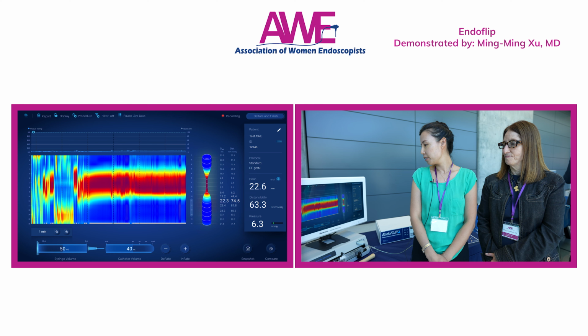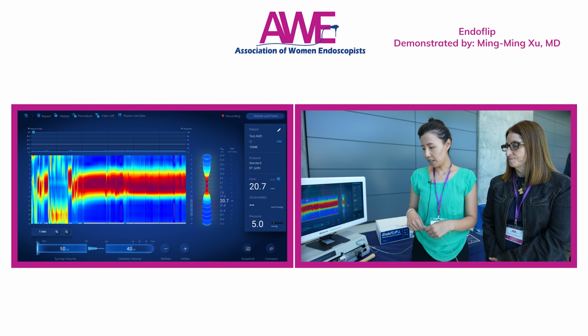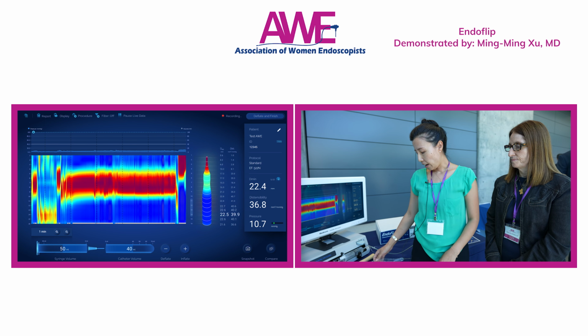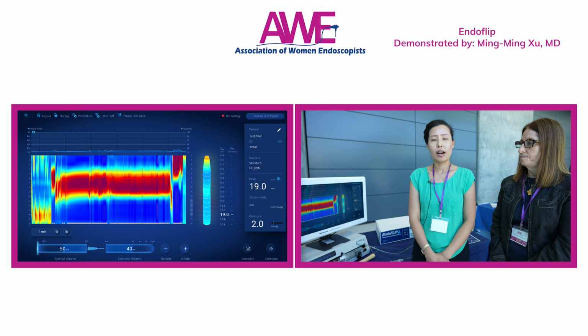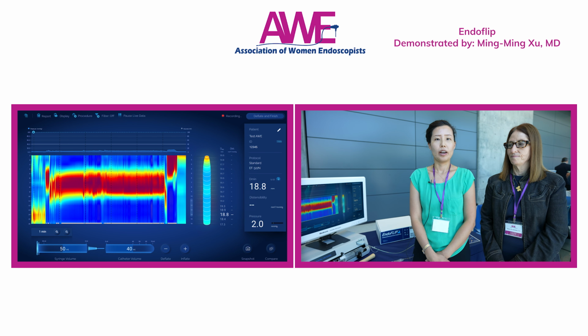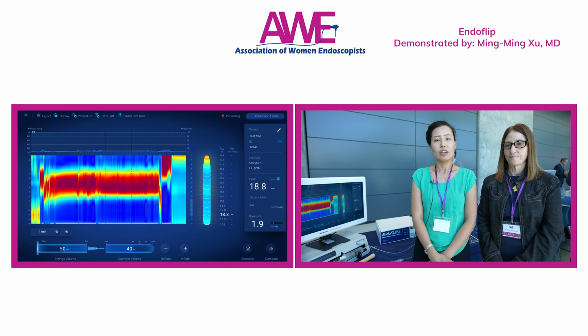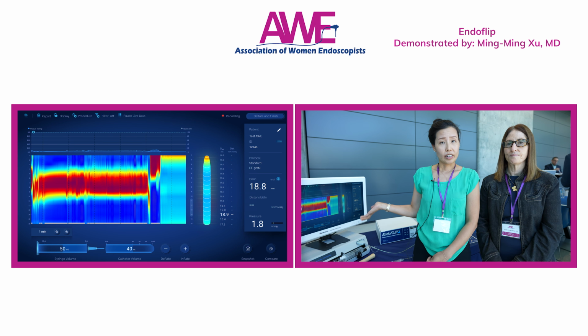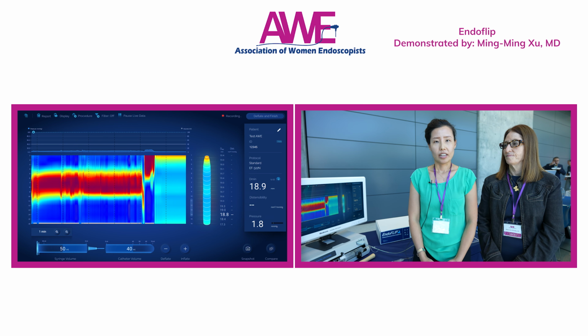And it's my pleasure to talk to you today about the Endoflip device, which some of you may already be familiar with, but I find this to be incredibly useful in my practice because I do per-oral endoscopic myotomy for the treatment of achalasia, and that is the application for which this device is really ideally designed.